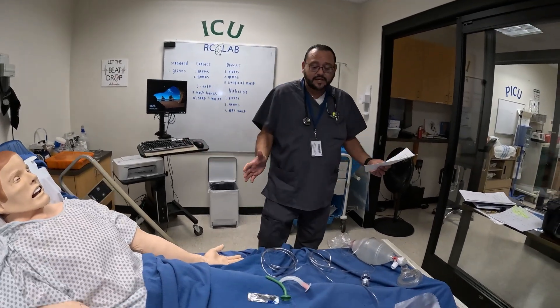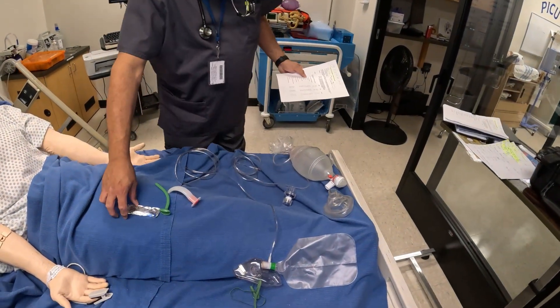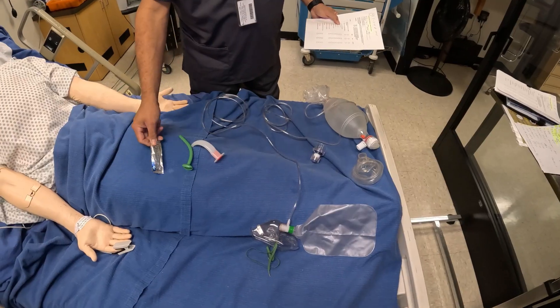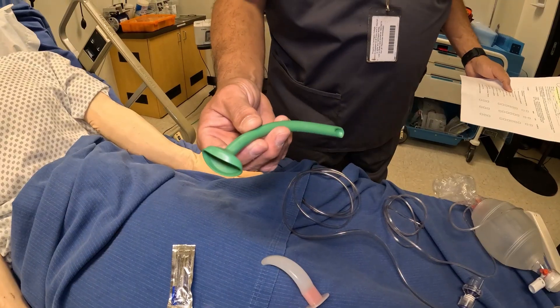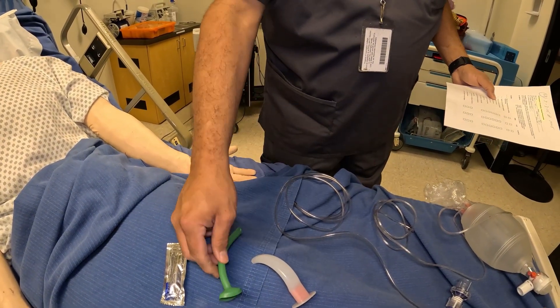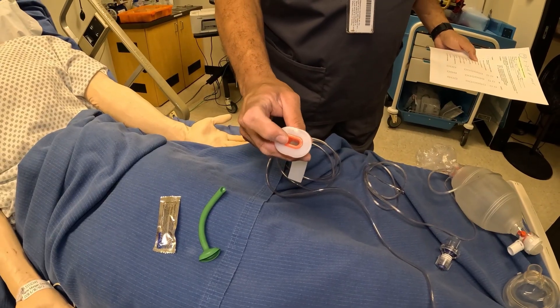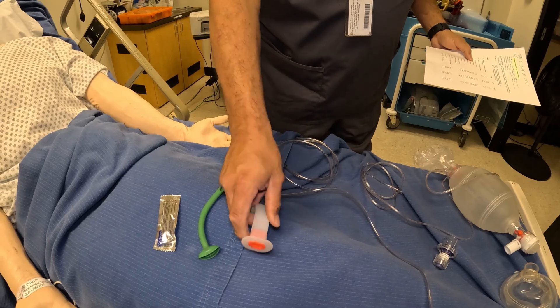Today we have lots of equipment spread out across the bed. We have lubricating jelly — make sure it is water-based and contains no petroleum. We have what's called an NPA, which comes in several different sizes. We also have an OPA, which also comes in different sizes and different types — you'll see ones with a hole down the middle and ones with grooves on the sides.